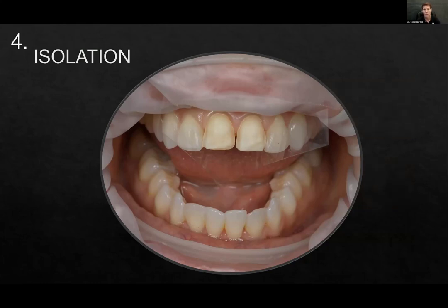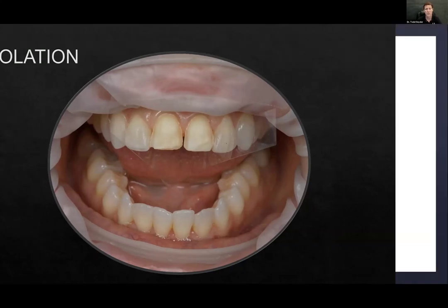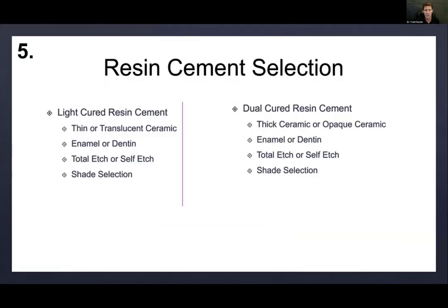And because of all the steps you've done, you've got to treat this very well with your technique. With your technique, you need to be very good at isolation. That means anytime you turn away to pick something up, your assistant obviously is keeping the area clean and dry. You want to make sure there's no contamination. But all the steps have to be flawless. And that's really what we're here to talk about, the flawless steps.